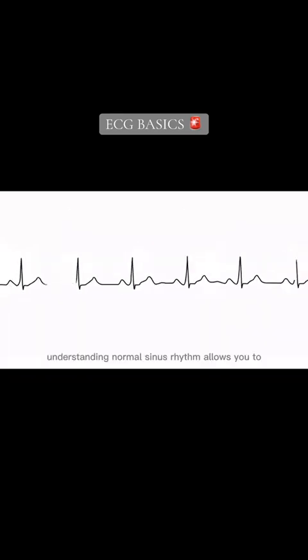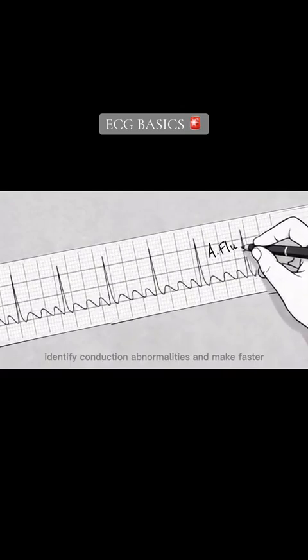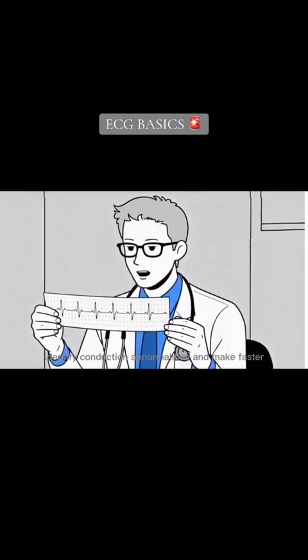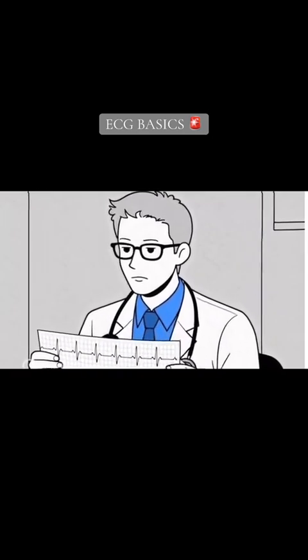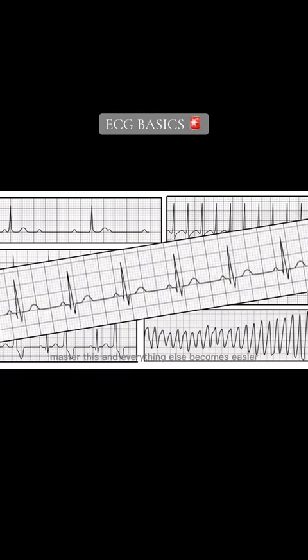Understanding normal sinus rhythm allows you to quickly recognize abnormal rhythms, identify conduction abnormalities, and make faster, safer clinical decisions. Every arrhythmia you will ever study is, in some way, a deviation from this normal pattern. Master this, and everything else becomes easier.